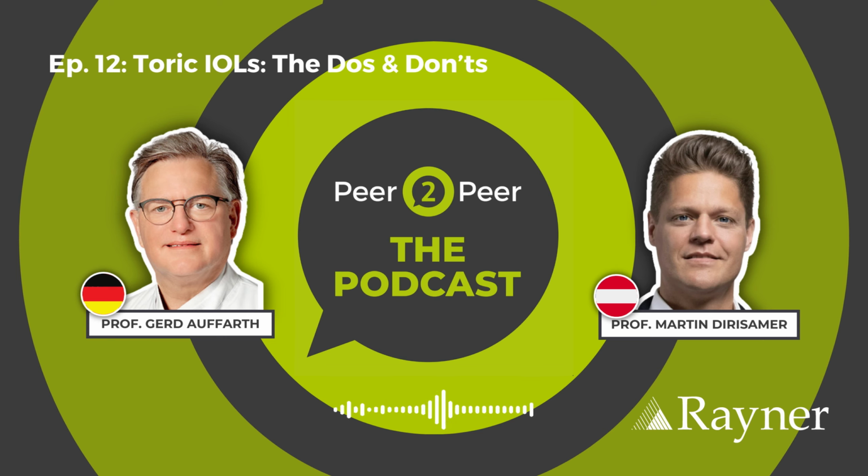Hello from my side as well. I'm very happy for this kind of invitation. Toric IOLs, I think it's a big topic and it's getting more and more important. Who is suitable for toric IOLs? I think we have to keep in mind that approximately 30% of all the cataract patients we deal with have more than one diopter corneal astigmatism. So they are suitable for toric IOL.